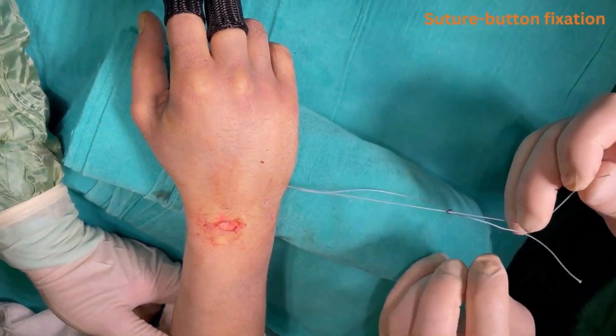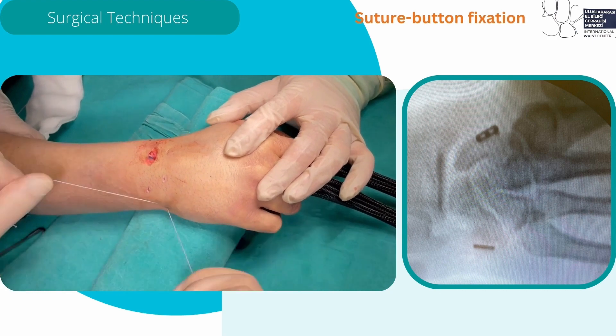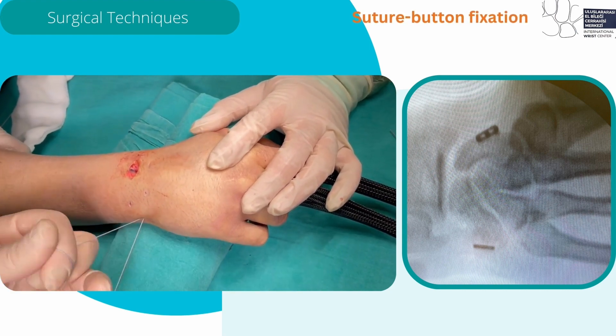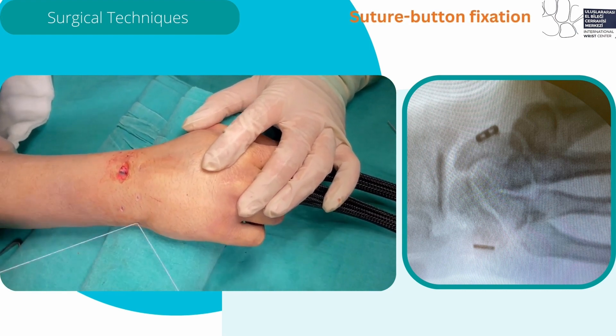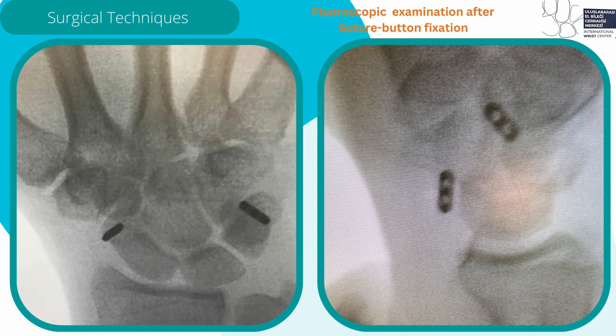The SB system is tensioned. Reduction is achieved by tensioning the system and checking under fluoroscopy after the first knot is tied. Multiple knots are then securely tied. This is the final fluoroscopic image of tensioning both suture buttons, showing reduction of the SL joint and SL angle.